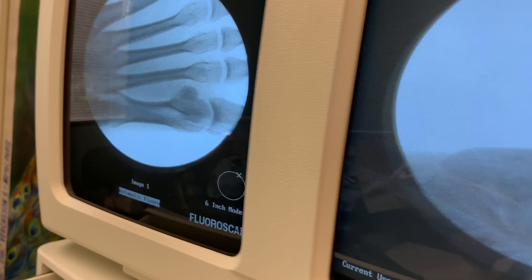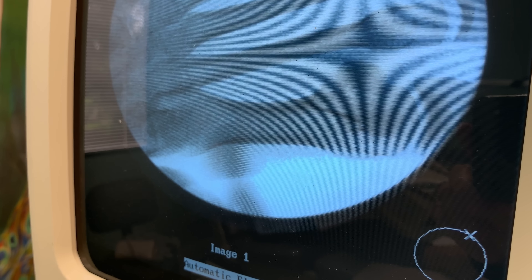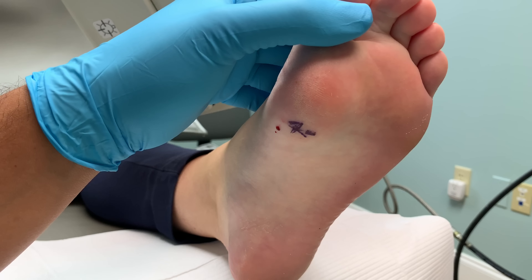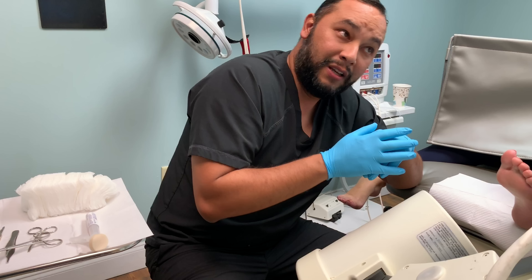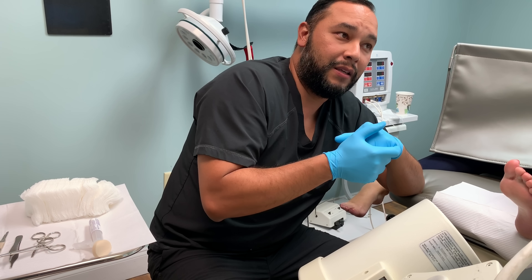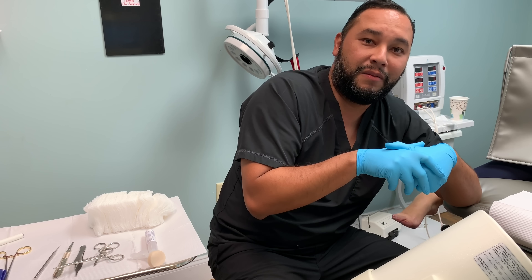Today we have a nice sewing needle and that is just the fifth metatarsal. You can't really see the sewing needle but let me see if I can get this on the TV. There it is. You can see it's somewhere over here, right there. I marked the spot on the foot so we're gonna start exploring where it is, find it, get it out, and she'll be on her way and won't have pain in her foot anymore.